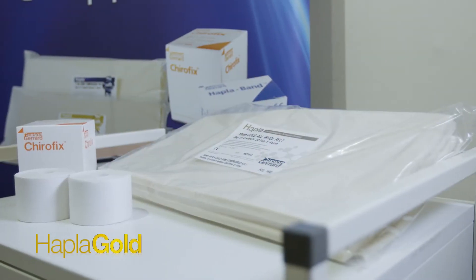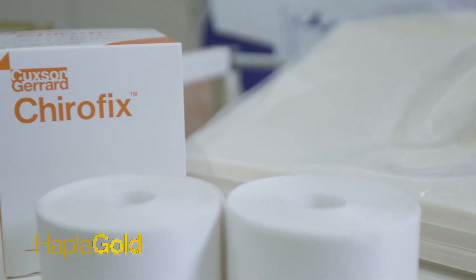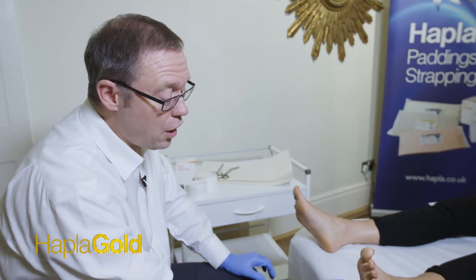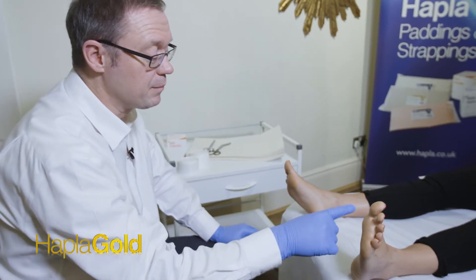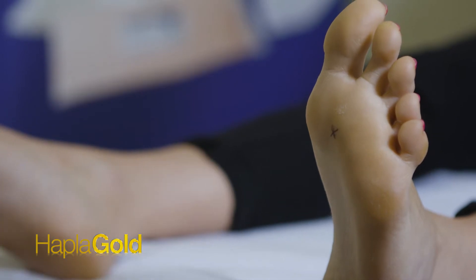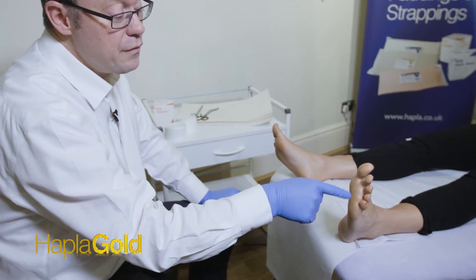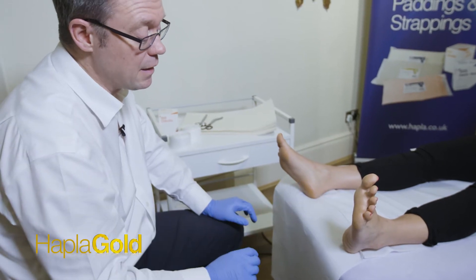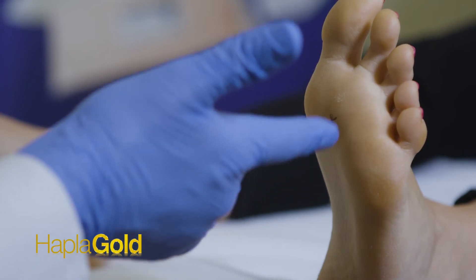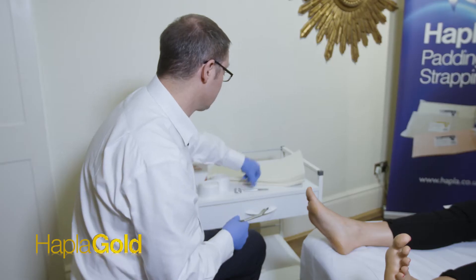Today we're going to look at the Hapler 3D system, which is a system using Hapler semi-compressed 10mm felt to offload an area on this foot. Ordinarily there would be an ulcer here, but we're indicating where there might be an ulcer with this cross, over the second metatarsal head. We're going to use this felt to create a rapid offloading system.